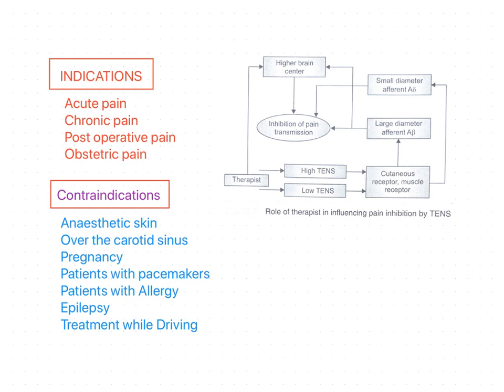And there are different kinds of pains. I have mentioned some pains like low back pain and neck pain, and also there are other kinds of pains, that is post-herpetic neuralgia, causalgia, peripheral nerve disorders, facial pain, metastasis pain, bone pain. The pain is due to cancer. In that case also TENS is used only for pain relief. Also orofacial pain, headaches and migraines, we can use TENS.